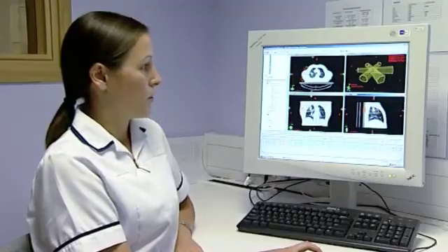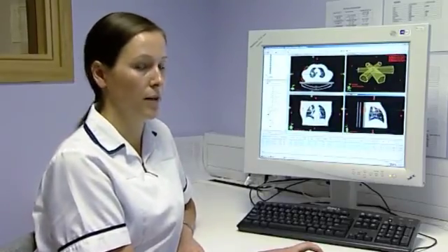The right post oblique that's not far from a posterior field has been angled slightly so we can avoid the spinal cord.